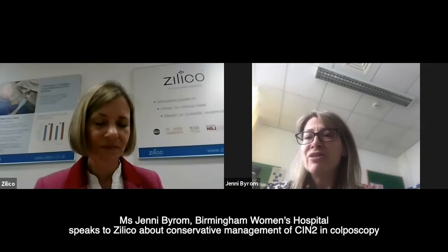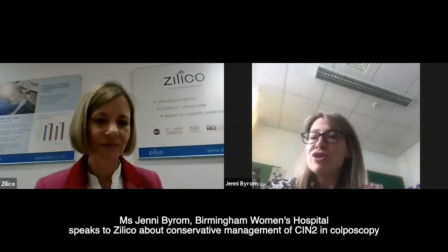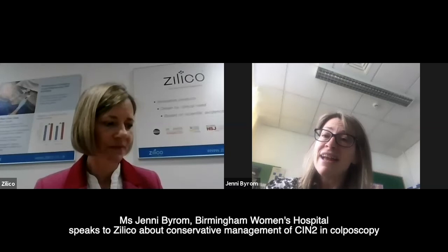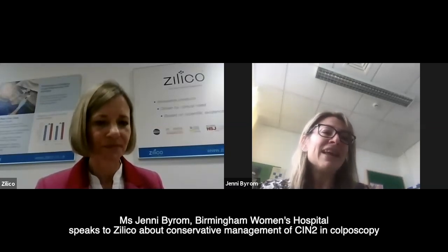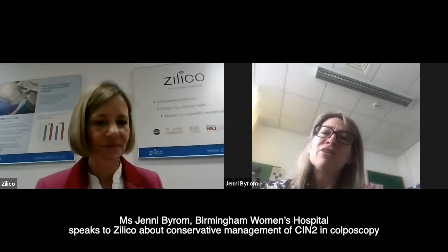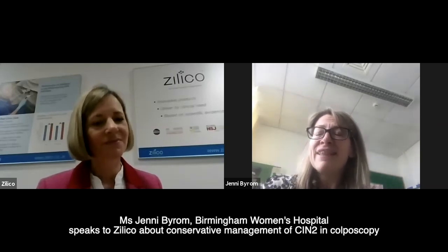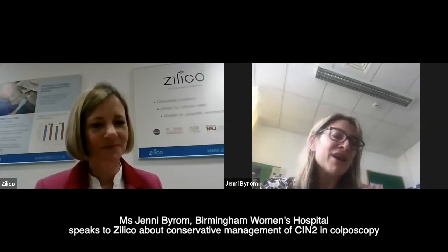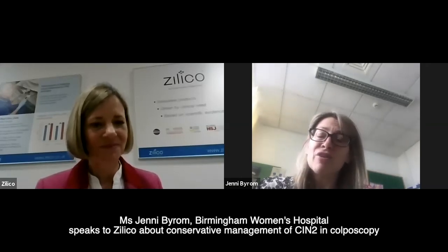Obviously, if women remained with high-grade cytology or lesions progressed, then we would offer treatment. And in those cases, the majority of them did have CIN3, so we felt we'd done the right thing to treat them. I wasn't alone at that time in feeling this, and many of my colleagues around the country were doing a similar thing. We all have in our heads what we feel is appropriate, and that's been reflected in the recent guidelines in document 20.